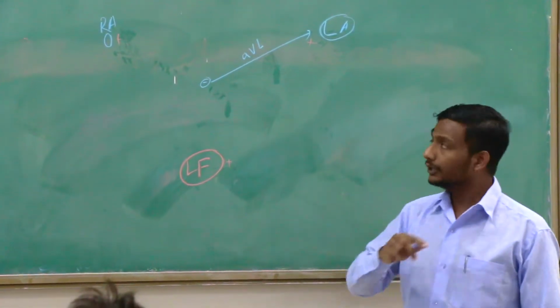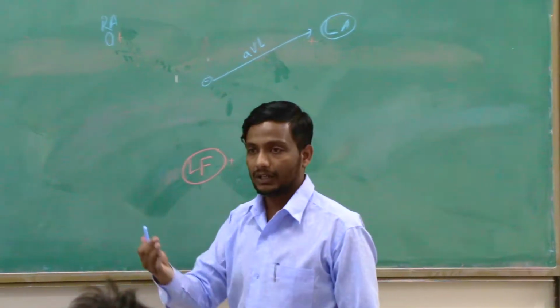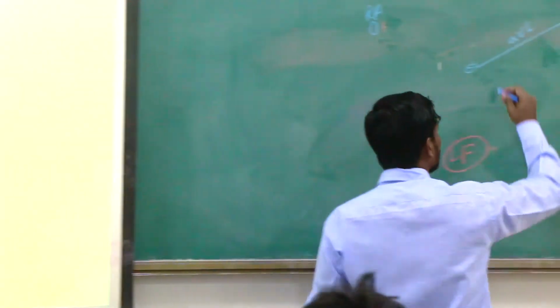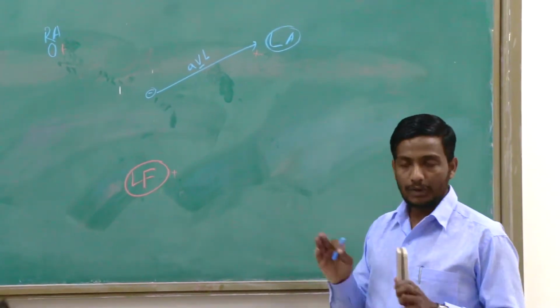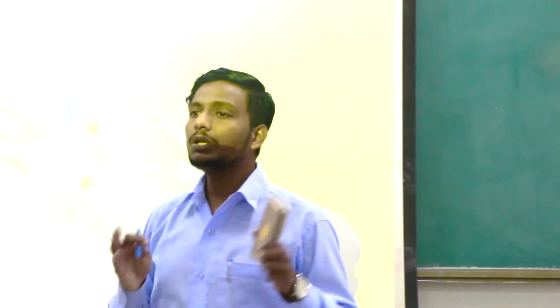By the way, let me tell you, whenever you see this letter A, it means this particular lead has been augmented. By the way, which electrode is the one to augment it? Right. The neutral electrode is the one to augment it. Right? So A. And I'm giving you one hint here. Whenever you see this letter V, now you convert the V into U. And you remember, U as unipolar. Right? You are going to remember them as what? Unipolar. Just an easy way for you to remember this.